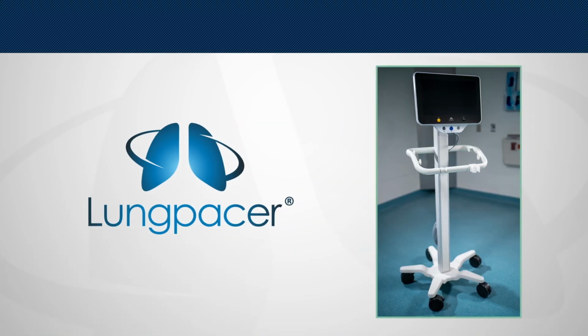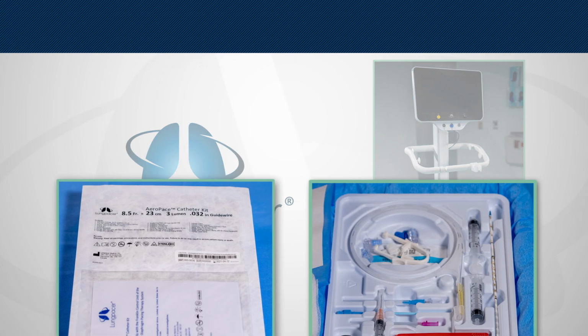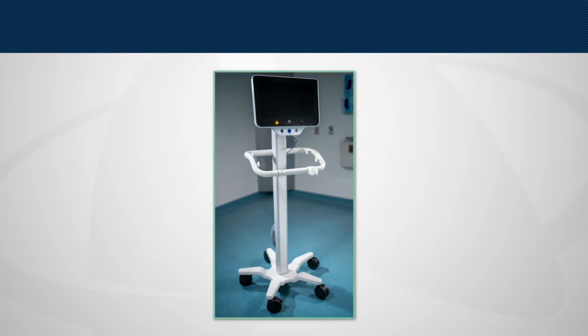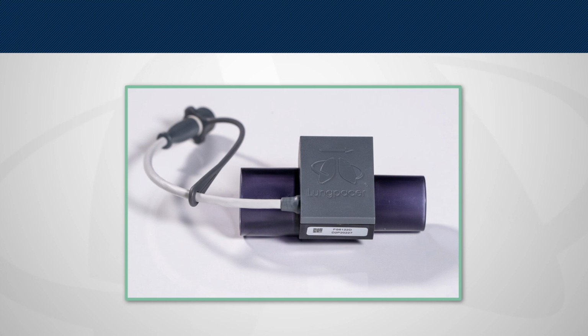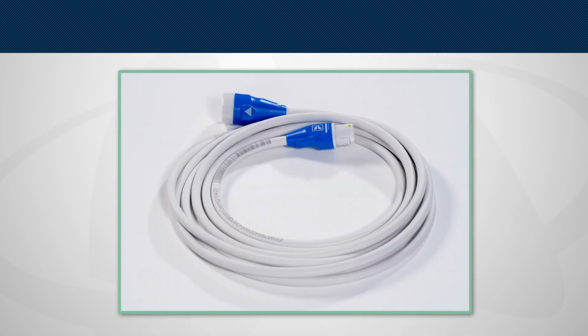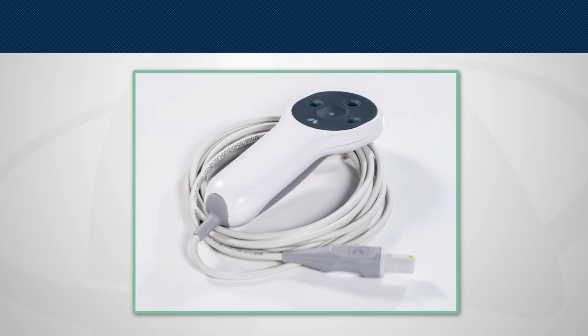The lung-pacer AeroPace system is a temporary, percutaneously placed transvenous, phrenic nerve stimulating device. 6 components comprise the AeroPace system: the catheter, provided in the catheter kit with single-use accessories, the neurostimulation console, the airway sensor cable, the catheter cable, and the handheld controller.